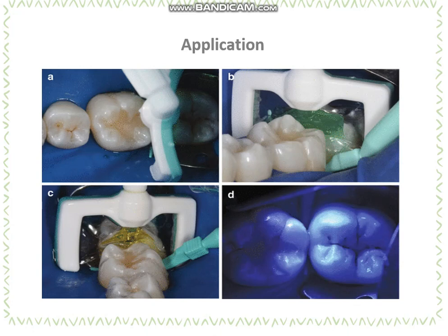We wash the gel, alcohol is applied for 2 minutes, and the tooth is then filled with a liquid resin which has a low viscosity. This resin is TEGDMA, which is triethylene glycol dimethacrylate, and is applied through a perforated sheath for 2 to 5 minutes. And lastly, we light cure the area for 40 seconds. Sometimes sandblasting is needed before applying the resin for the penetration step.